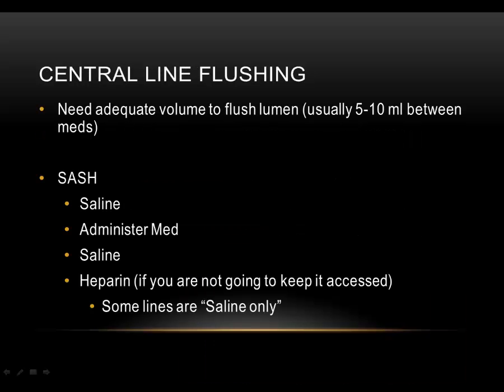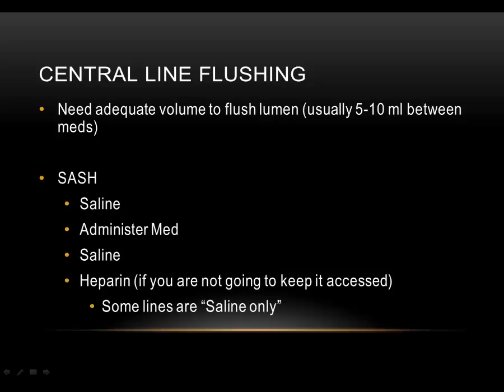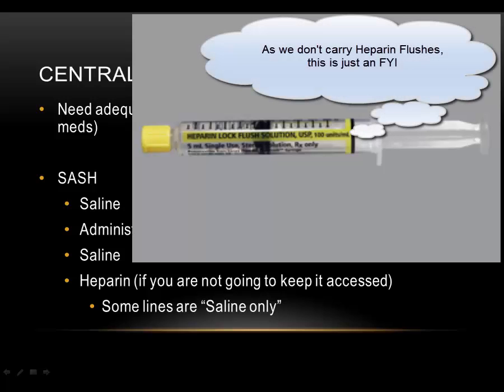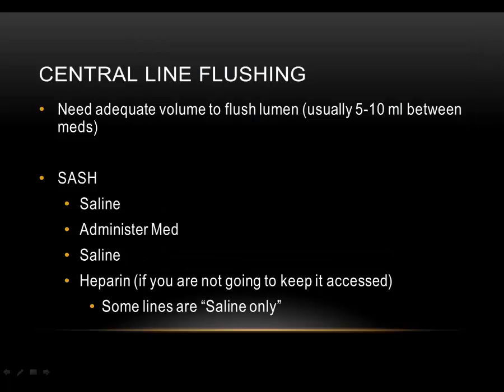When flushing central lines, you can use the mnemonic SASH. Push saline to ensure the line is patent. Administer the medication. Flush it with saline to make sure all the medication gets into the vein. And then add heparin as an anticoagulant to keep the line from getting clogged up. Remember, some lines are saline only.